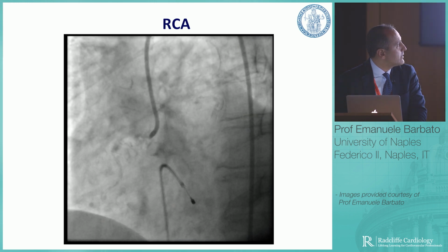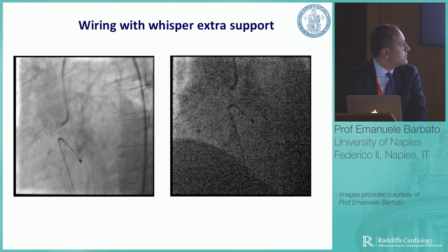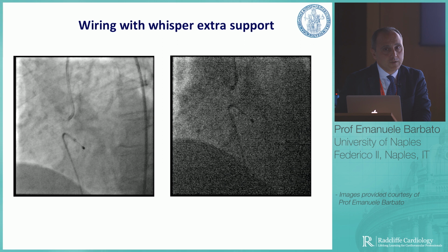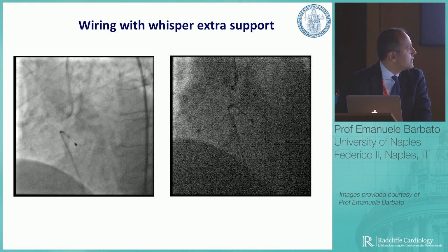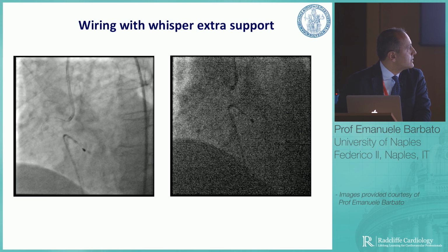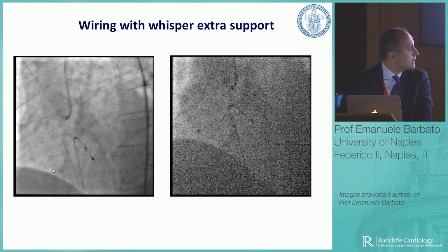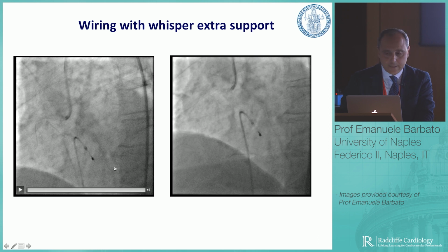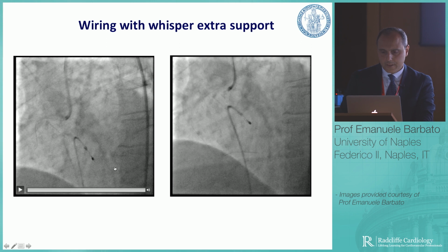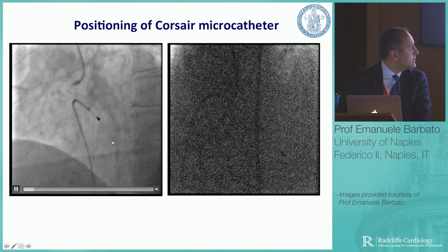Now the first problem here comes with the wiring technique. I mean, you are CTO experts. I don't have to tell you anything here. What I used in this case was a Whisper Extra Support. I was just mingling around a bit, but then it eventually went in. Wire is positioned distally. I took in this time a Corsair. Yeah, place it distally there.